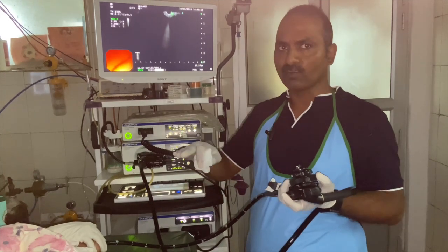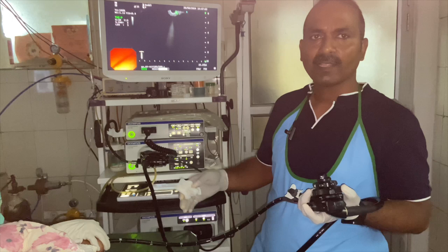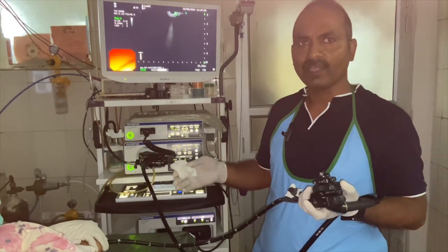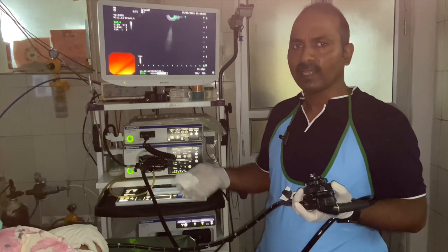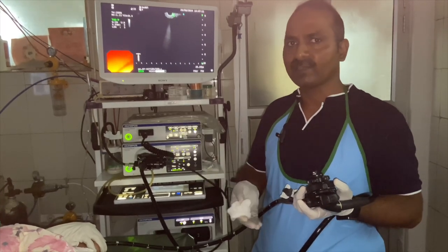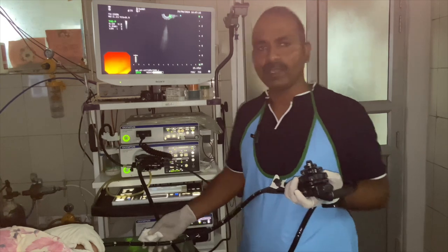Then further clockwise move, giving the torque to the scope, we localized the left hepatic vein, and with the help of left hepatic vein, segment 2 and segment 3 were delineated. In line with the segment 3, away from the probe was the segment 4B of the liver.